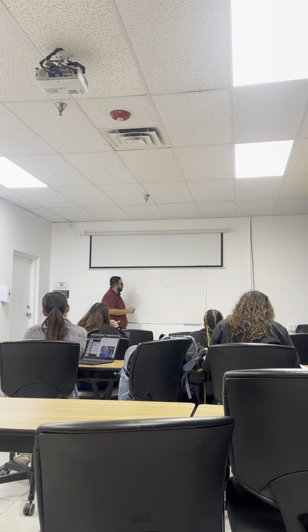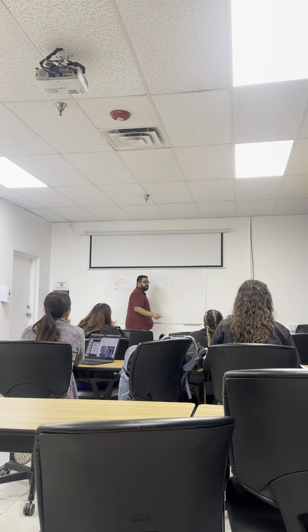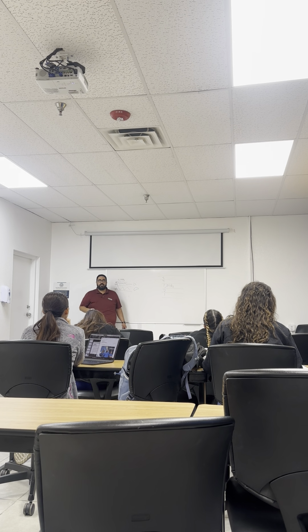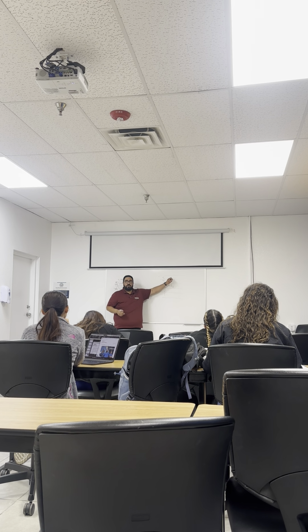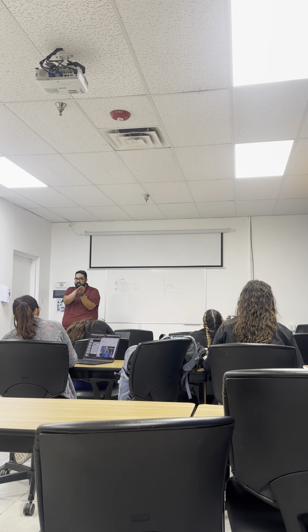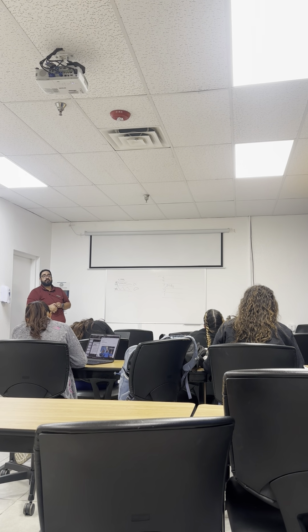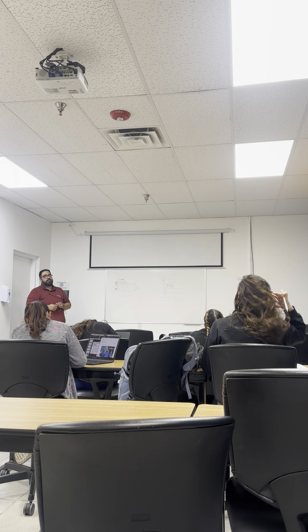Okay, so each of these will be put into its own category with its own image. And then each of these images will be compounded together, layered together, and that'll fill in the gaps that the pictures have. So each frequency is compensating for whatever the other frequency is losing. Yeah.